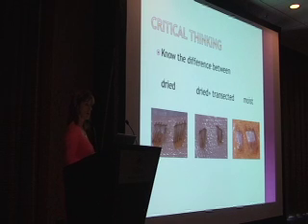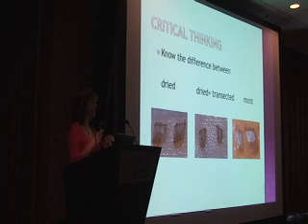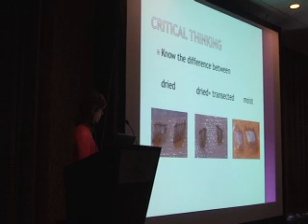And the same thing here, another point to make here is that the grafts should not dry. If they dry, they don't grow. So I have a picture of a matte look, so there's no glossy, shiny look to the tissue, which means the tissue is dried. If the assistant leaves the tissue on a dissecting board too long or on a hand without spraying it, hydrating, the tissue will dry out and the end result may be poor growth or no growth. So the tissue should not look dry, it should look shiny, and this is transected plus dried out tissue. So I wanted you to see what it looks like, what shouldn't be done, in order to guide your assistant how to do this correctly.